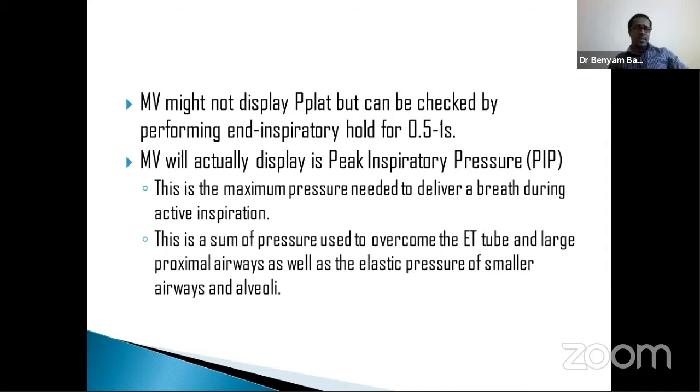Most mechanical ventilators do not display P plateau, so we have to do a maneuver to assess where the P plateau is. How do we check that? We add the time for an end inspiratory hold, and we put it at 0.5 to 1 second. By doing that, you are creating a delay after inspiration before the onset of expiration. By making that delay, you'll be able to see the plateau pressure.